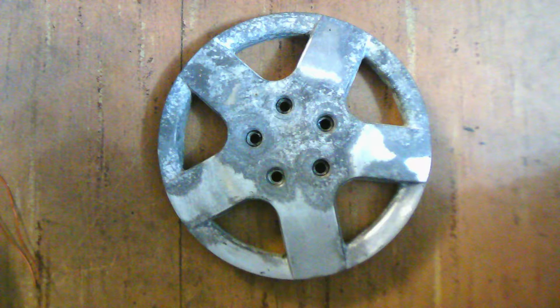The amount of time it will take for you to get paint stripper to loosen paint will depend on which paint stripper product you choose. Read the label to find out how long it needs to work. My product required 20 minutes. When the paint stripper was removed, this is what my hubcap looked like.